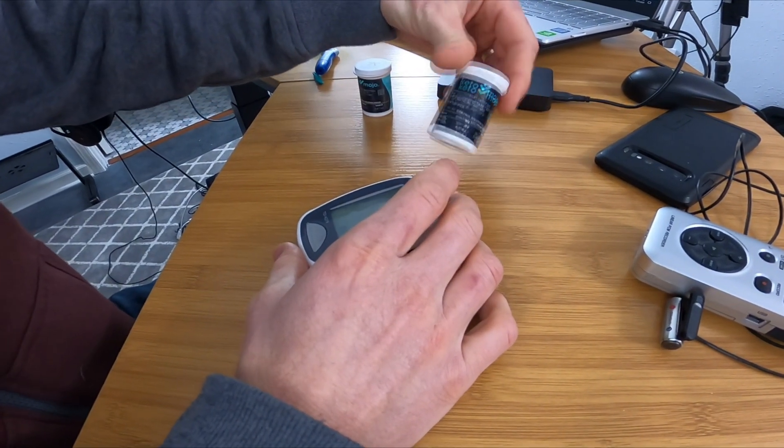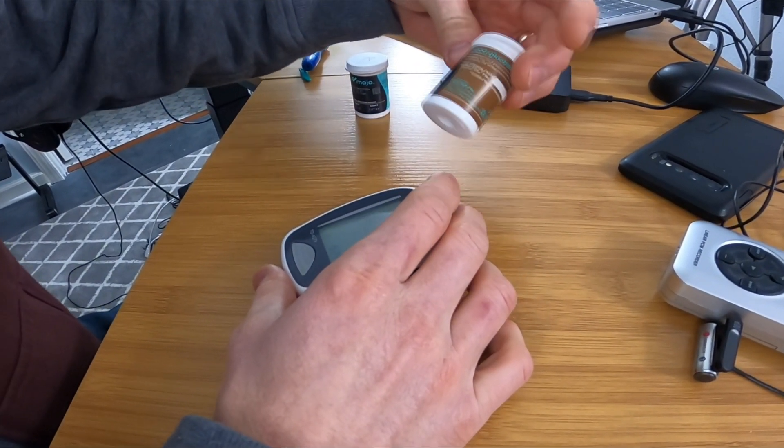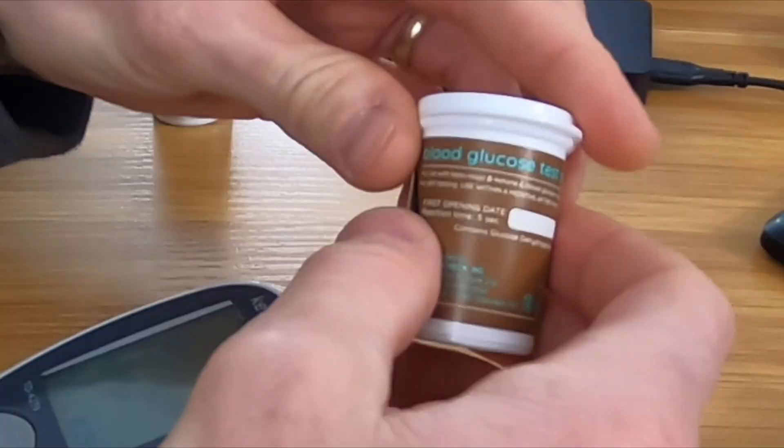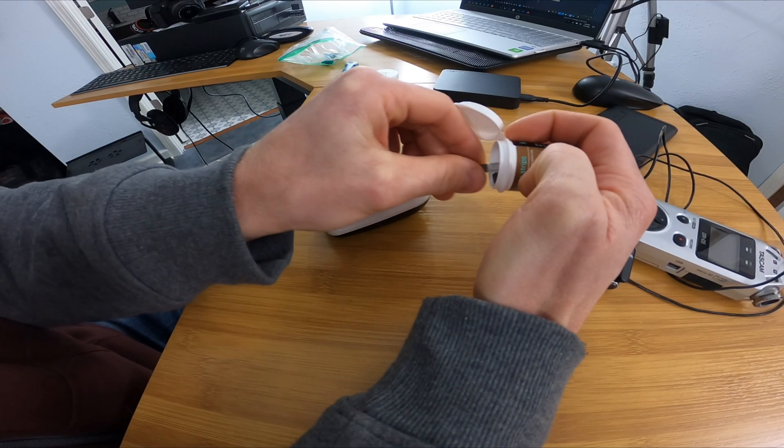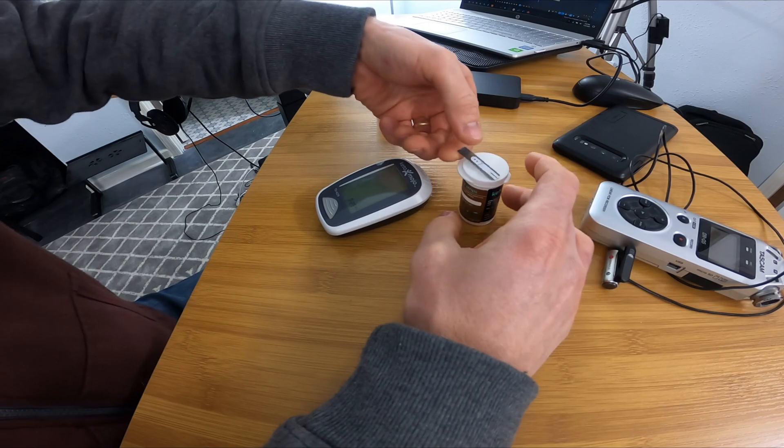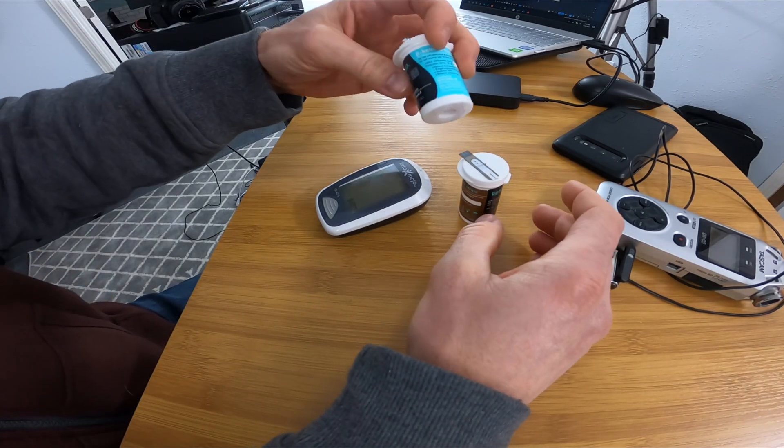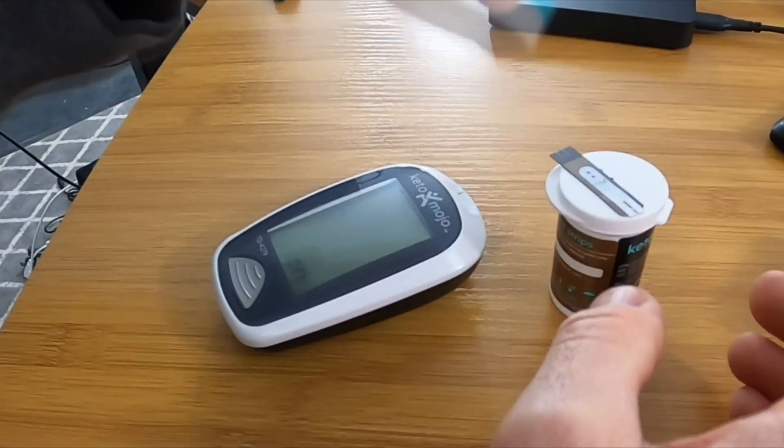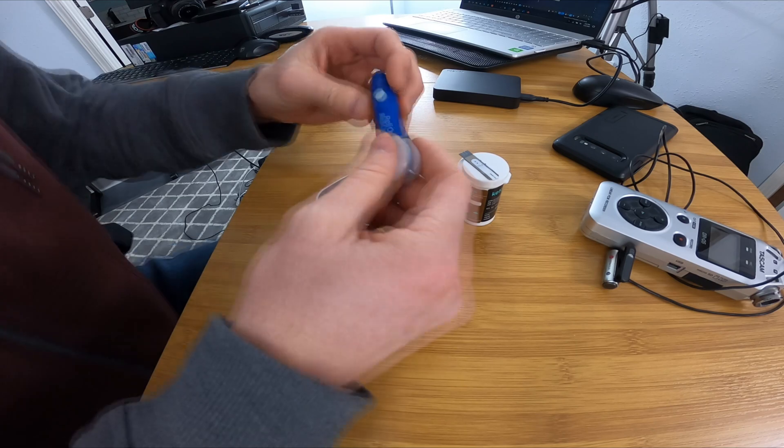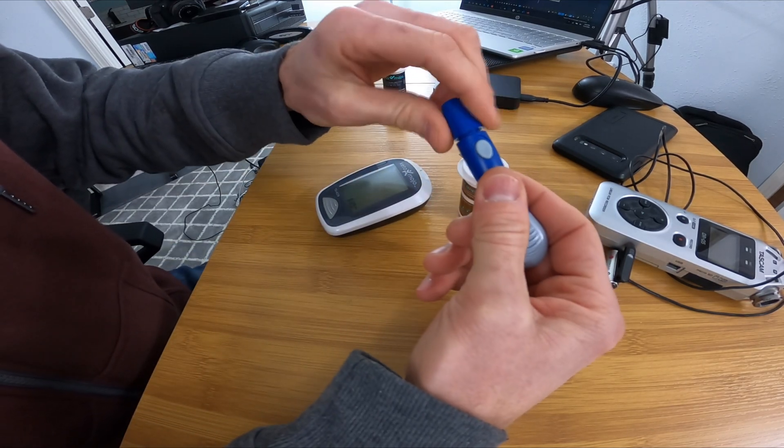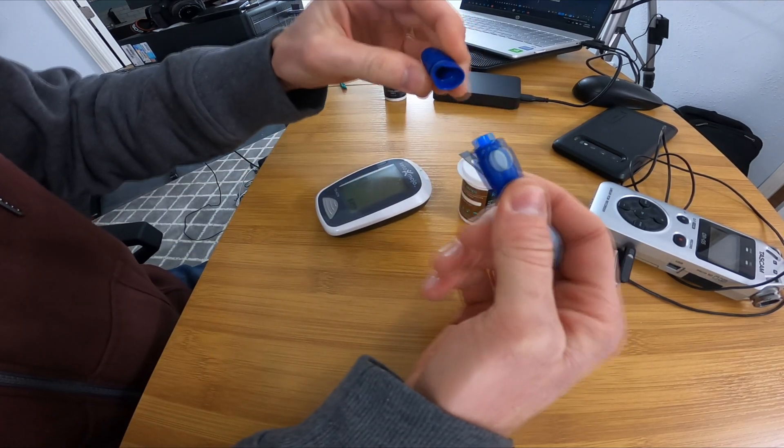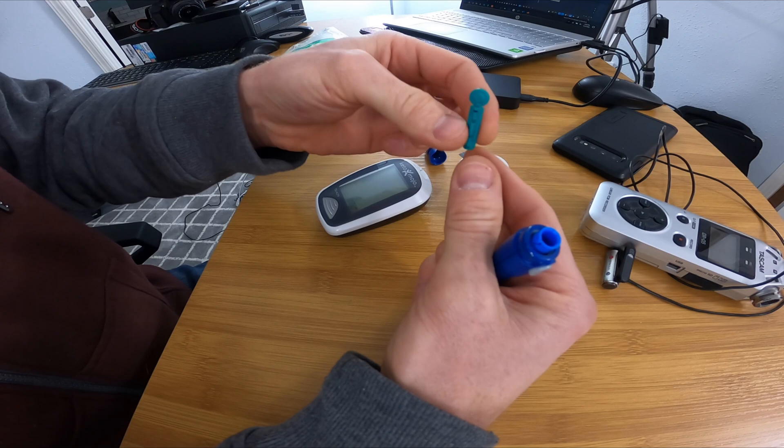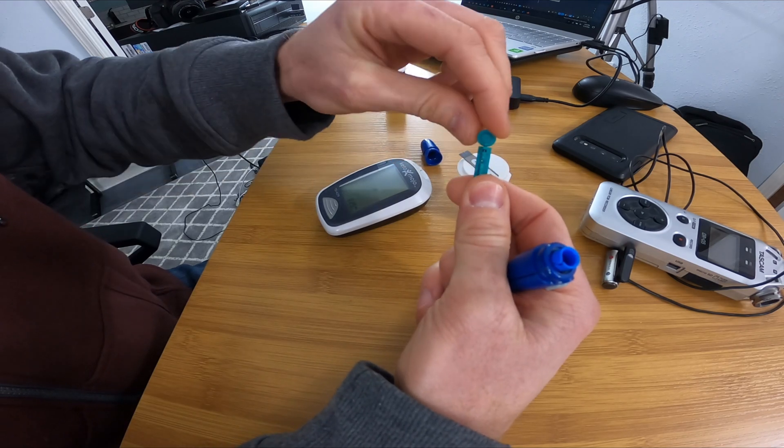The first thing you do is take out a strip, make sure it's a blood glucose strip and not a ketone strip. Now here's the lancet. It has a spring-loaded system on one end and a little cap that you remove on the other end. This is where the microneedle will be inserted.